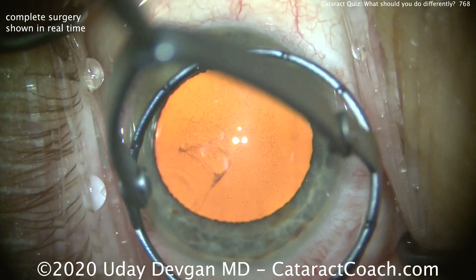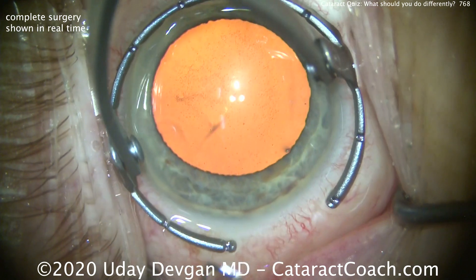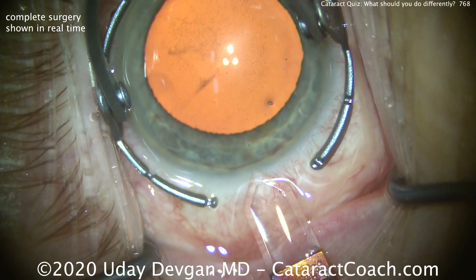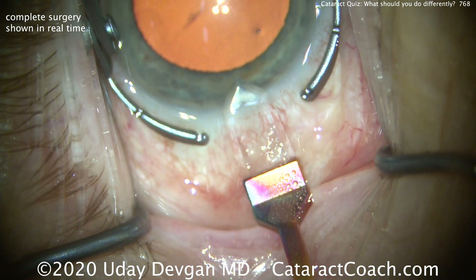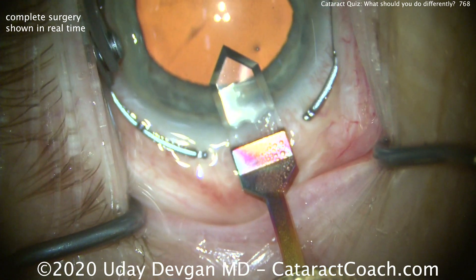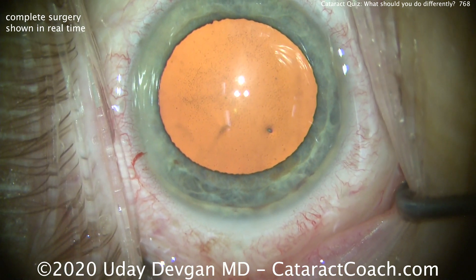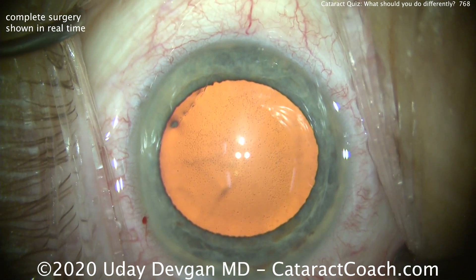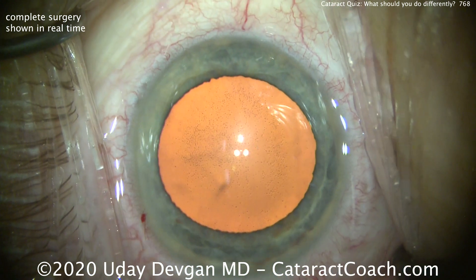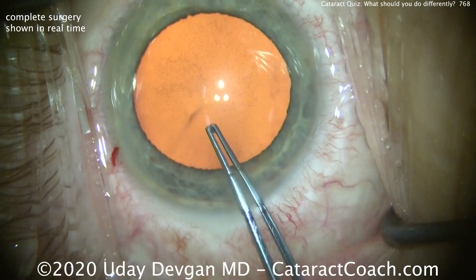We just coated the endothelium with a dispersive viscoelastic. It's very important to use a high quality dispersive viscoelastic. This is not the case to use HPMC — hydroxypropyl methylcellulose — because that dispersive agent doesn't stay around as well in the anterior chamber and doesn't protect as much. You want a good agent.